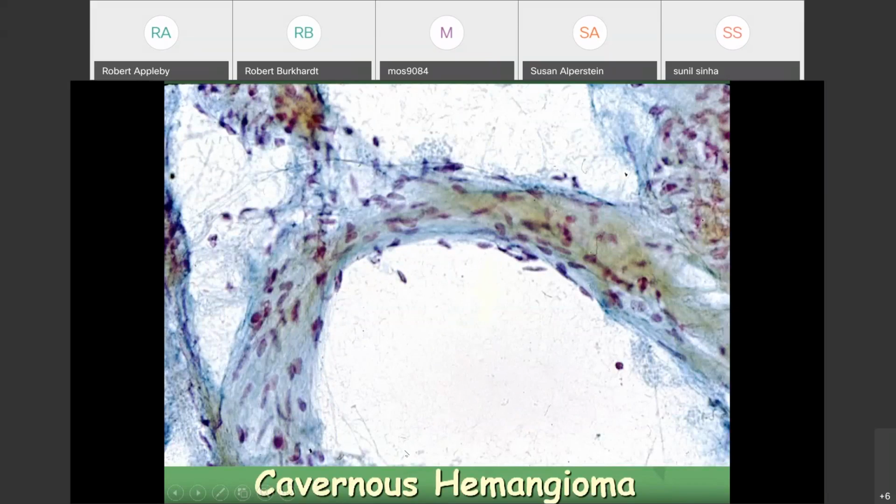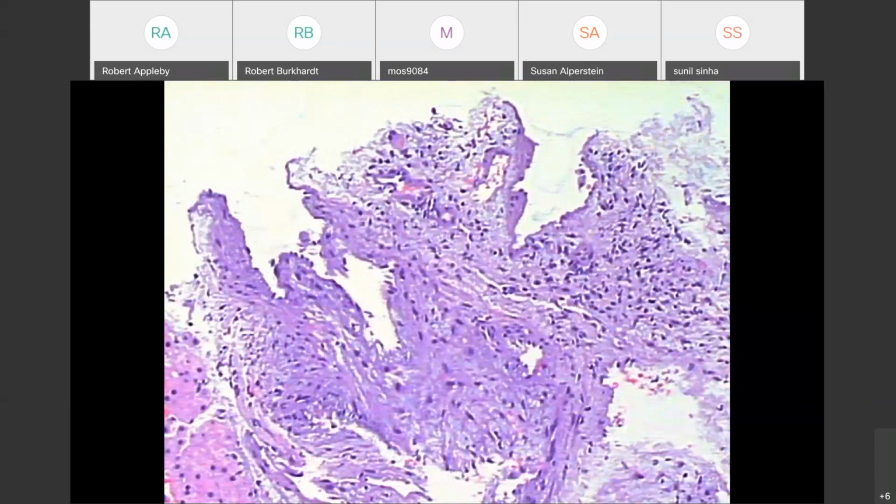And so when you have cavernous hemangioma, it's very important to request the radiologist to do a core biopsy, because nothing will happen, and it will be diagnostic. Here it is. Because very few people could concur with cytologic diagnosis of cavernous hemangioma, but everyone could recognize histology.